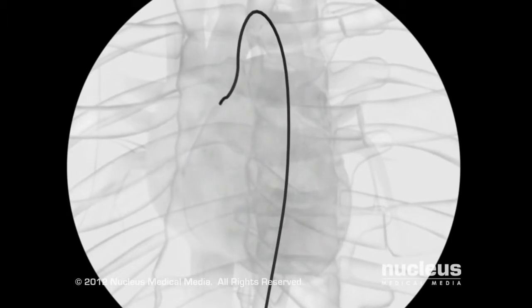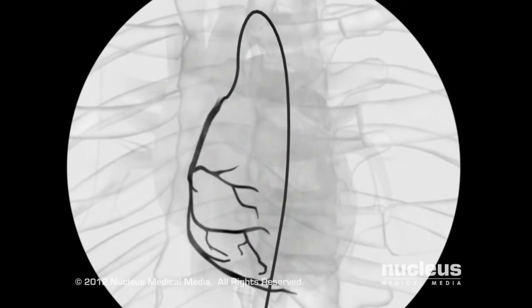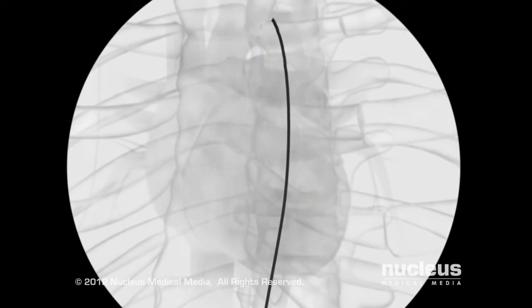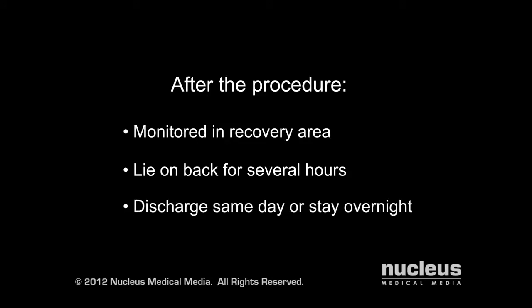After sufficient images of both coronary arteries and their tributaries have been recorded, the catheter will be removed through the groin. Pressure must be applied over the femoral artery to prevent bleeding. You will then be taken to the recovery room for 30 to 60 minutes of observation, after which you will be required to lie on your back for several hours with a pressure bandage in place over your groin. You may either be discharged home on the same day or after an overnight stay in the hospital.